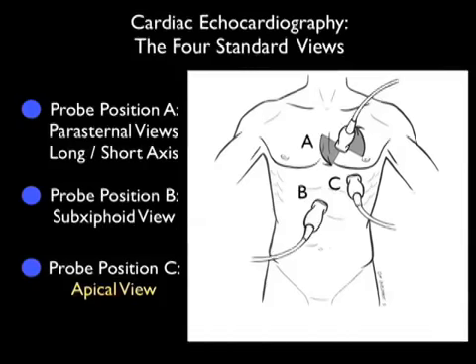So in conclusion, I'm glad I could share with you the SoundBites module going over the apical views of the heart. This is an often neglected view, but one that gives a great deal of information about your patient's heart and really should be routinely integrated into the cardiac echo examination. It's best to move the patient into the left lateral decubitus position to optimize imaging from the apical view of the heart to see all 4 chambers of the heart in relation to one another.